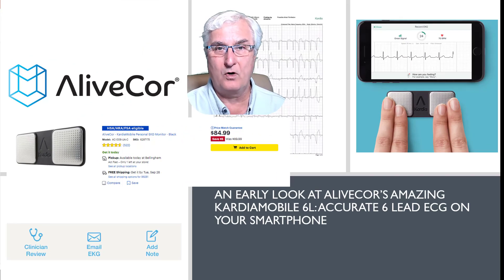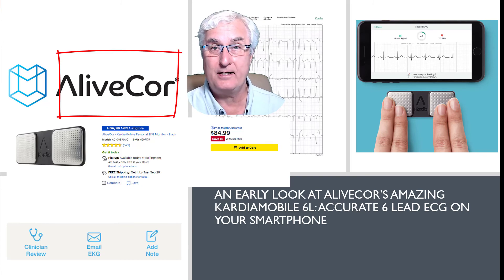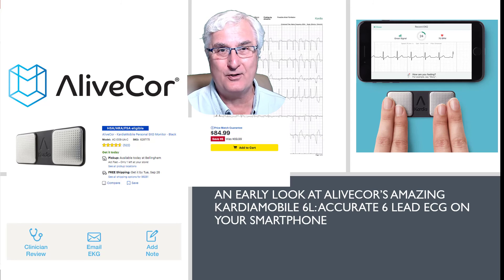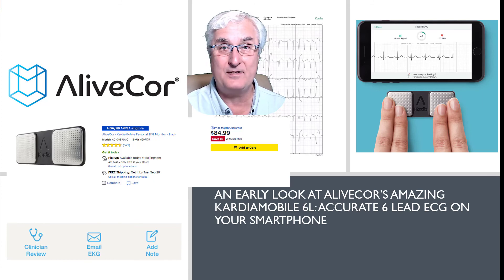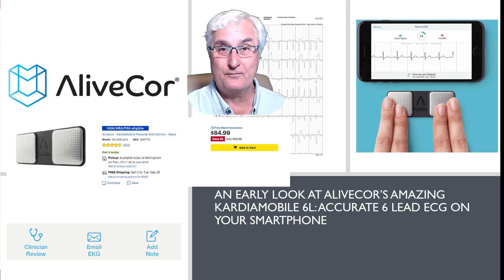If you don't have a smartwatch and you're still interested in the ECG app, there is a company called AliveCor. They make a device called KardiaMobile, which can be purchased at Best Buy for under $90. This device has an app and attaches to your cell phone. It's small and can fit on your key ring, and it can diagnose atrial fibrillation. It is FDA approved and stores the ECG on your phone so it can be emailed to your healthcare provider.